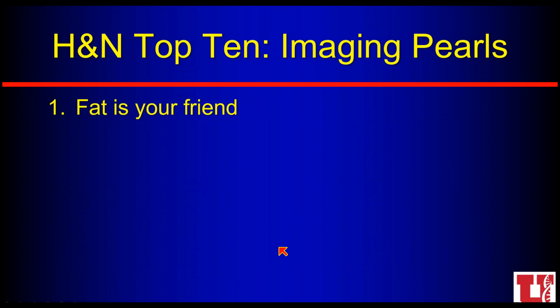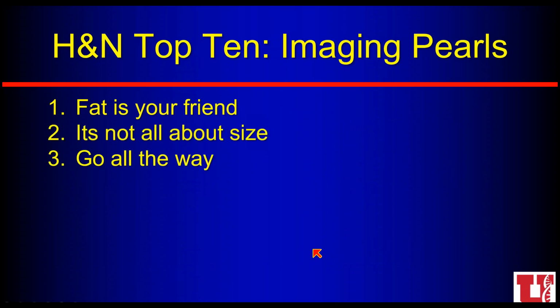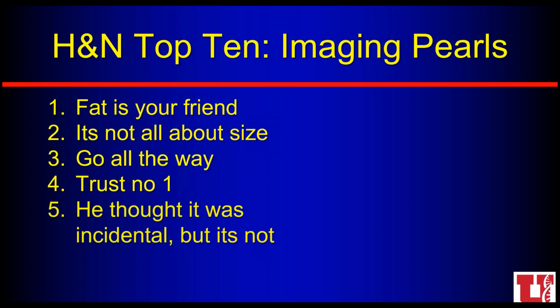I want to remember that fat is my friend. I want to remember with lymph nodes, it's not all about size. I want to look at the imaging characteristics of them. I want to remember to image all the way with cranial nerve evaluation. I don't trust any of the prior reports. I do read them, but I don't blindly believe everything they say.